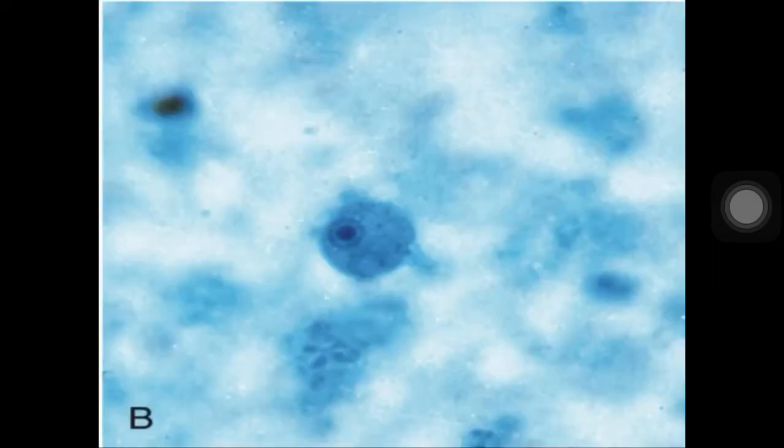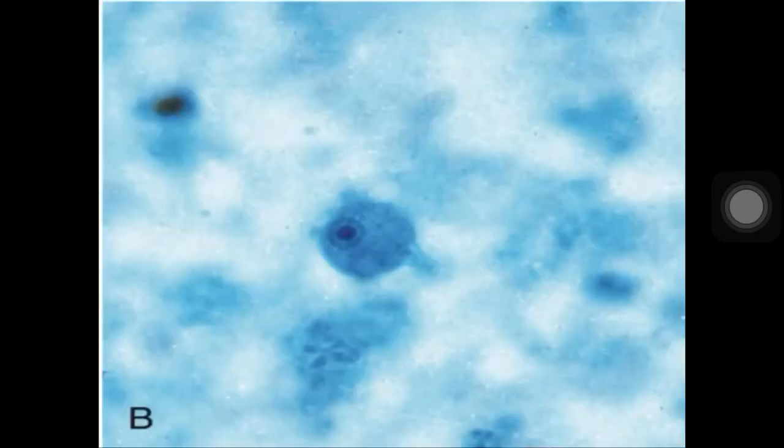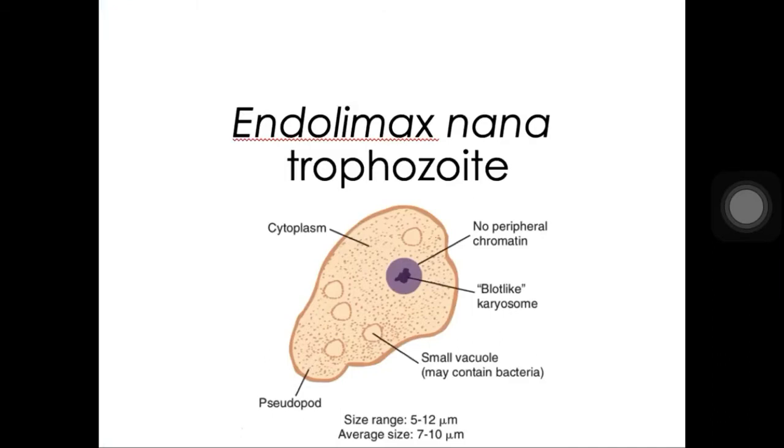Okay? Image number 6. Okay, next image. Okay, nahulaan na po ba? Again, balikan ko. Okay. Hindi pala nahulaan. Na-identify na po ba? Ayan. Okay, so this one is your Endolimax nana trophozoite.